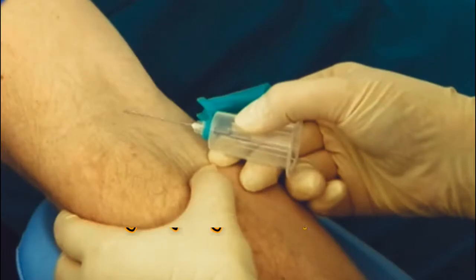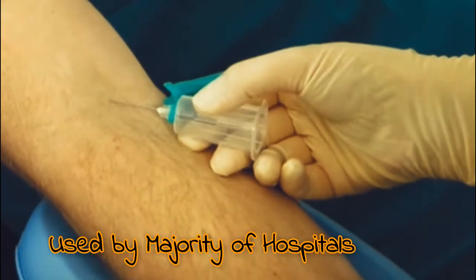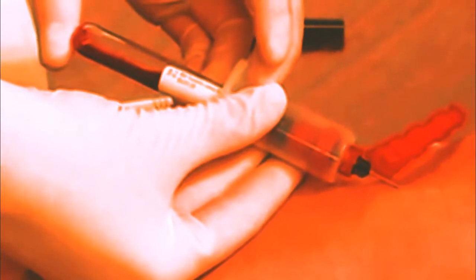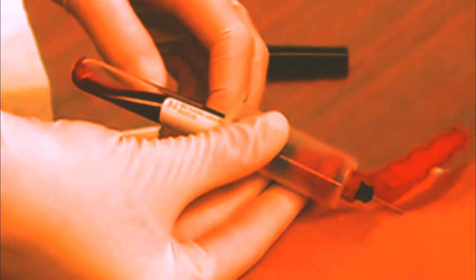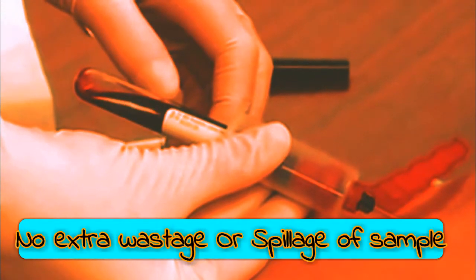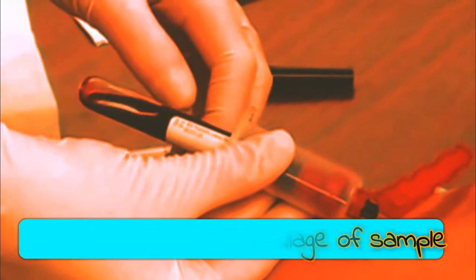After that, now the majority of hospitals are using a vacutainer system. This vacutainer system is the most approved or most effective system in phlebotomy environment because there is no extra or any wastage of blood. We collect the appropriate amount according to the vacuum of the tube. You can see in the video.